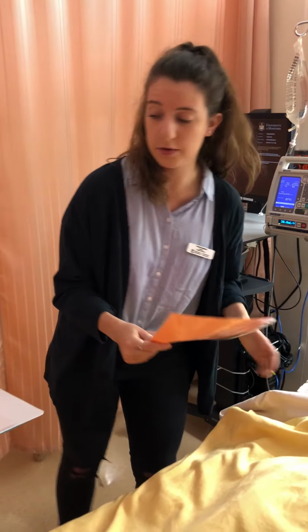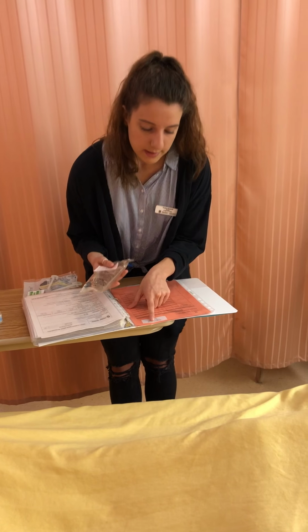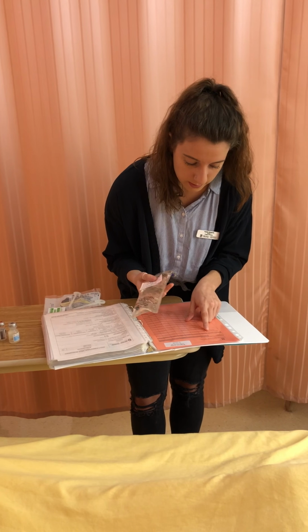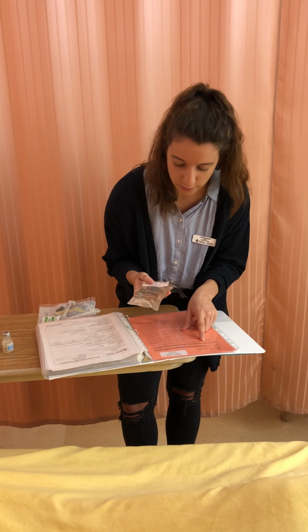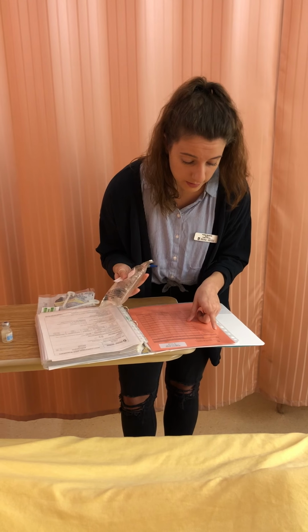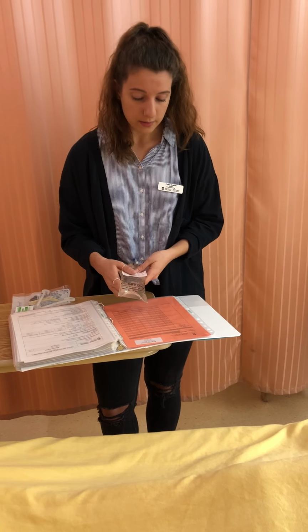Okay, so I'm just going to go do my third check now. So right patient, Emma Wrightson, which I checked already. Right drug is Zithromax. Right dose, 400 milligrams. 400 milligrams is in this bag. Right route is IV. This will be given IV, and the right time is daily. So right now, I can give it.